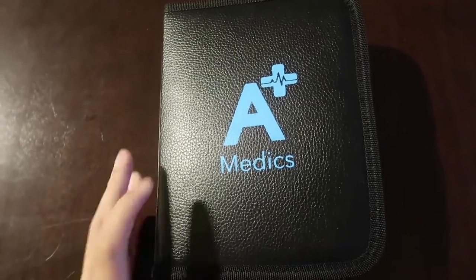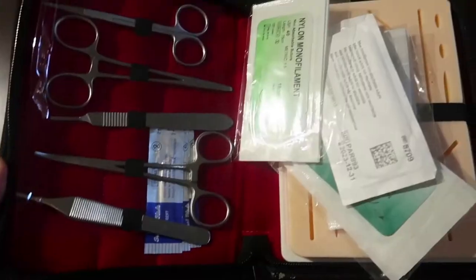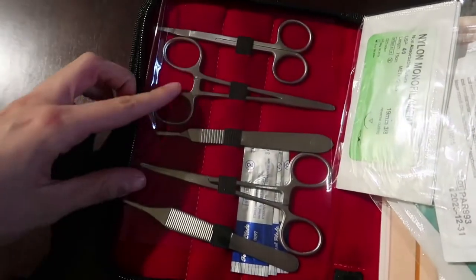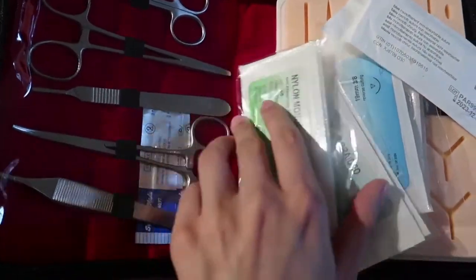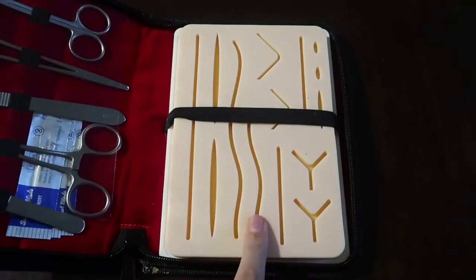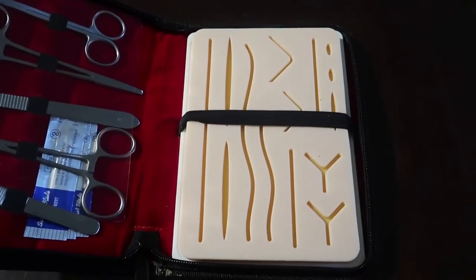So it looks like this. It comes with a really nice container to hold everything, and inside you get all the tools on the left. You get extra scalpels, a whole bunch of different suture types, and the silicone pad that you can practice your suturing with.